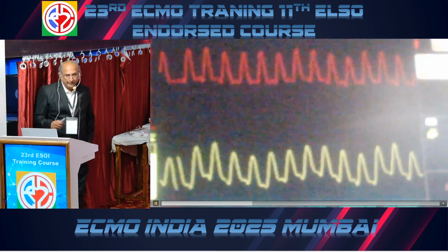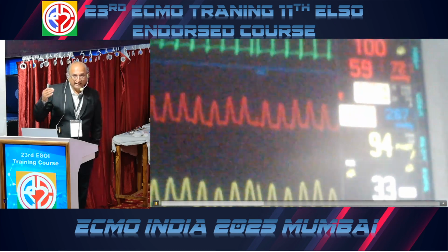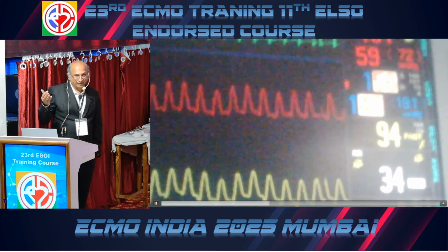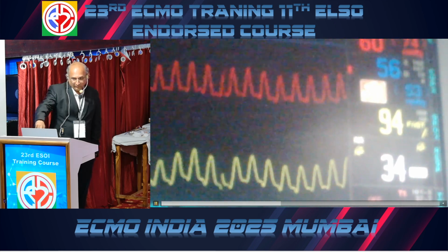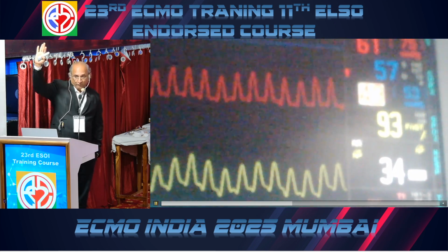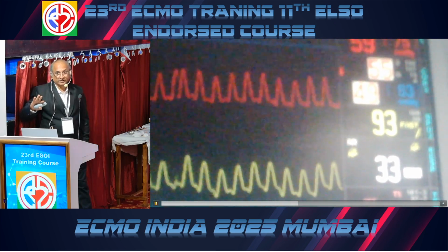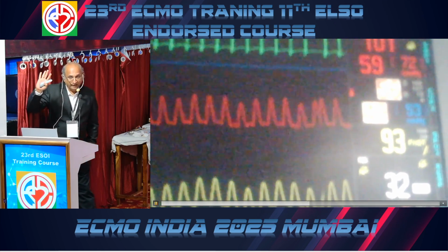While weaning, we found that the delta pressure was gradually increasing, but he was remaining stable, non-efforting. See, this is the post-oxygenator pressure, 53. So pre is 350, post is 53. So the delta pressure was 300. That was a high delta pressure.